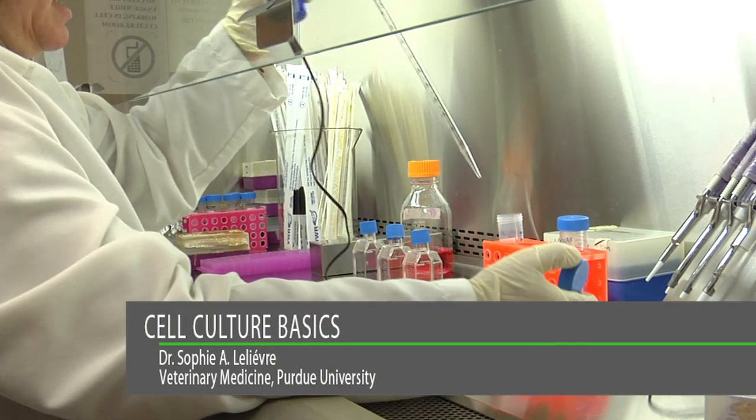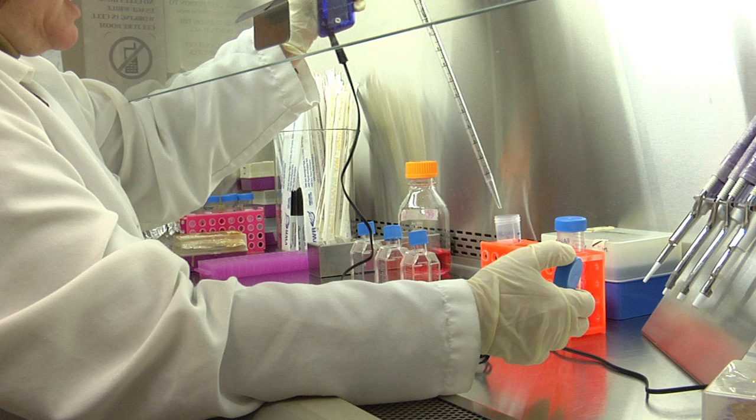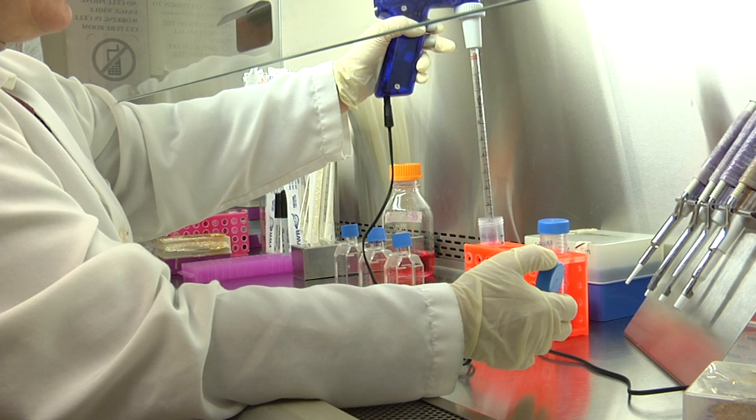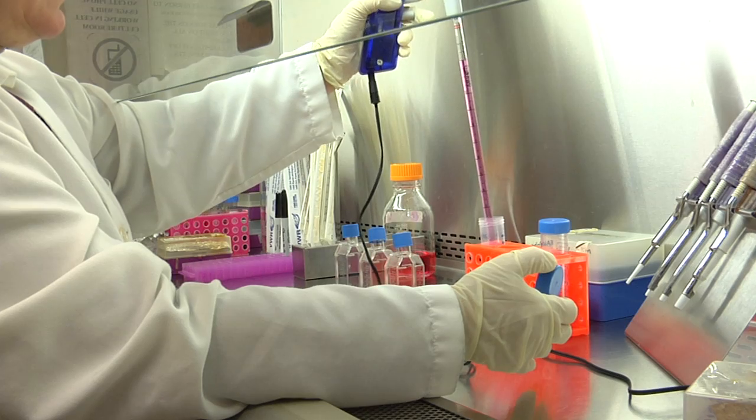When adding medium to flasks with cells attached on the culture surface, it should be done away from the cells in order to avoid injuring them. As shown before, you may take the total quantity of medium for a series of flasks at once and add in a serial manner to the flasks. This should only be done for a small number of flasks — three at most — and only if you are expert at manipulating cell cultures safely, yet quickly enough, in order to prevent the surface on which the cells are resting from drying out.